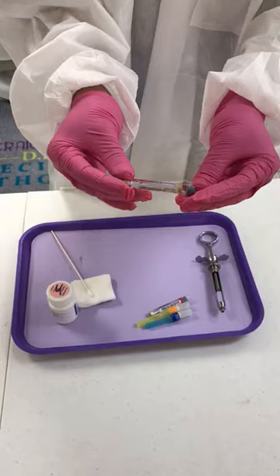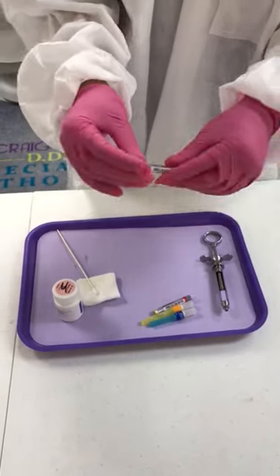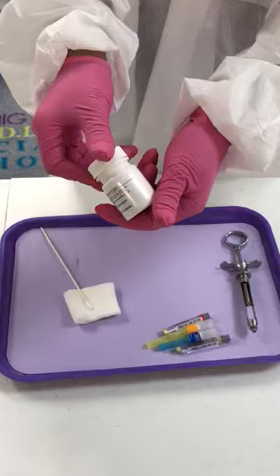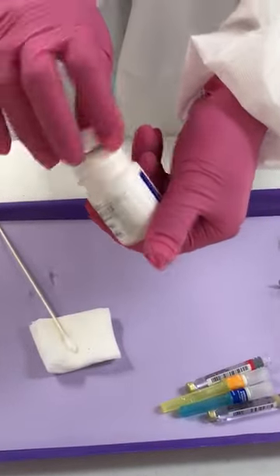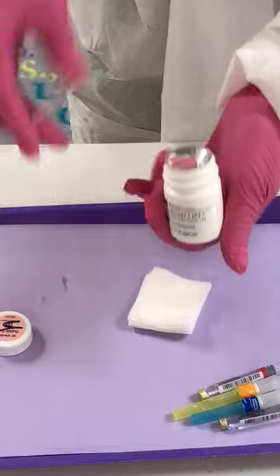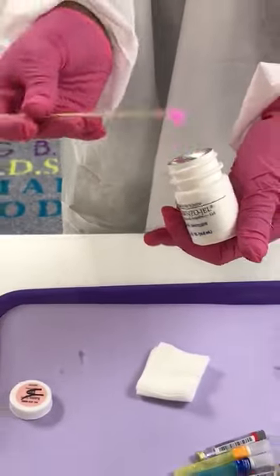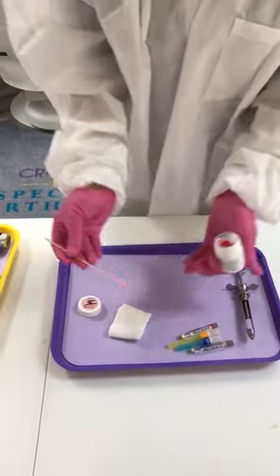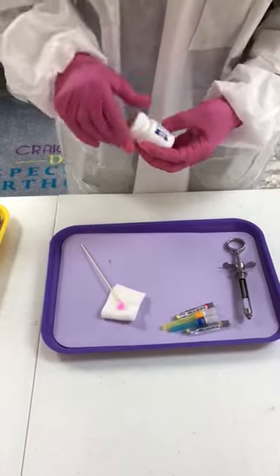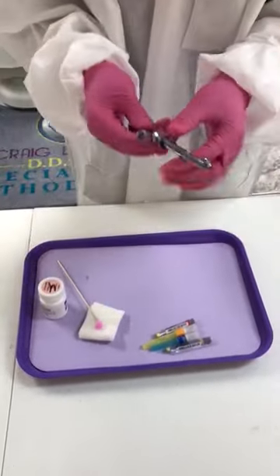Sometimes we'll use carbocaine on patients that are either pregnant or have had any kind of heart issues. This is called topical anesthetic — this is what we use on patients. We'll swab it and rub it on the gums so the patient will not feel the pinch as much when they're getting numb.